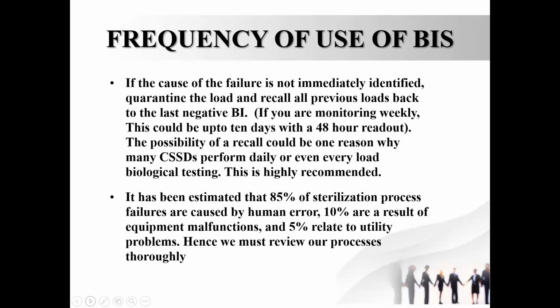They would like to use it daily or even for every cycle. I would personally highly recommend this. If you do it daily, then you have to recall only one day's loads. If you do it every cycle, you have to recall only the load of that particular cycle and not several days' loads. Okay? So this next point is very, very important.